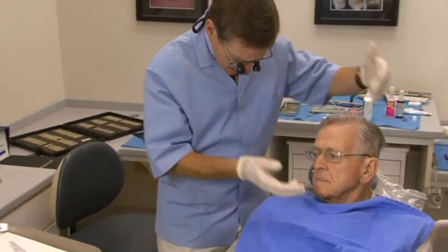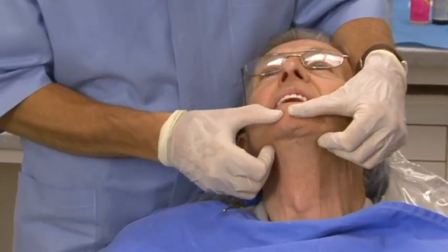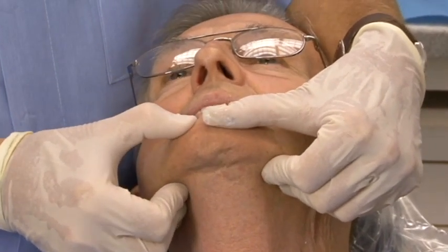Having the wax try-in stage is an excellent way to kind of set the hook on a patient — let them know here's what it's going to look like, here's what it's going to feel like. One other thing I want you to do at your wax try-in: put your head back, open just a little bit, and let your jaw just relax. Gently close.